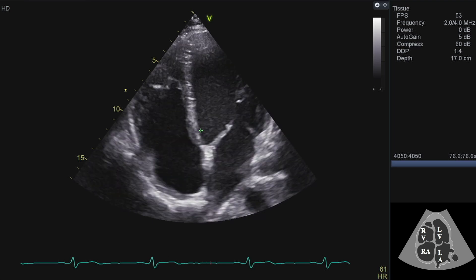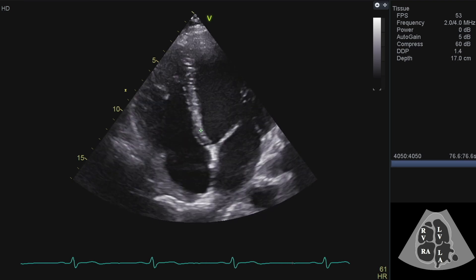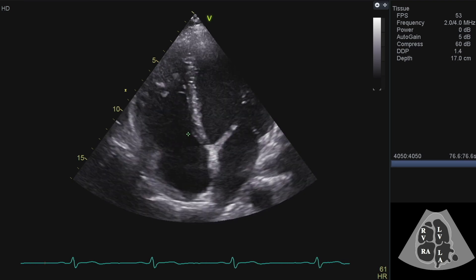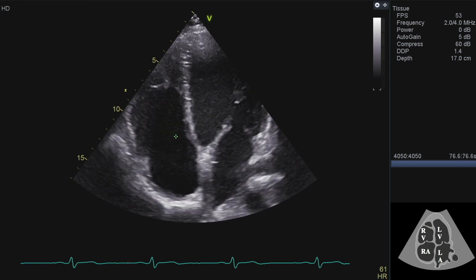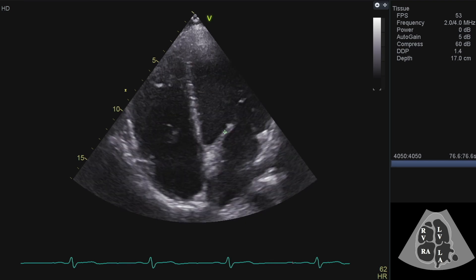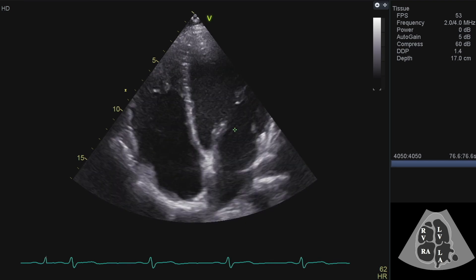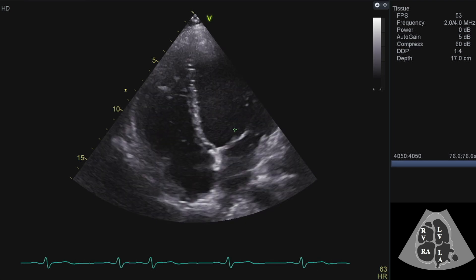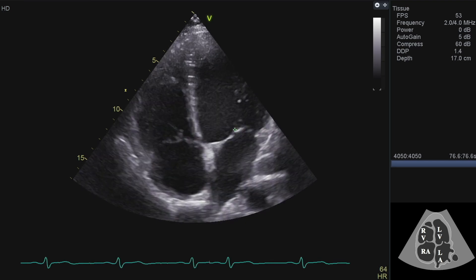It's usually around five millimetres. If there's no offset and the valves look like they're in a line together, that would make you start wondering whether there was congenital heart disease.